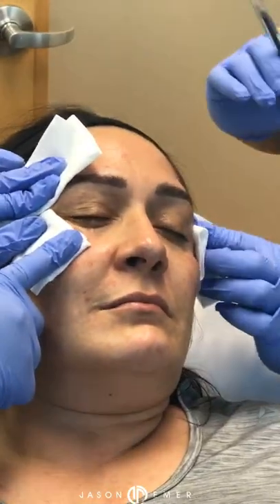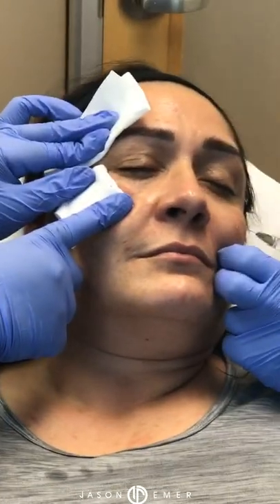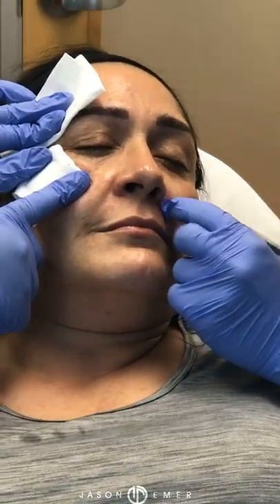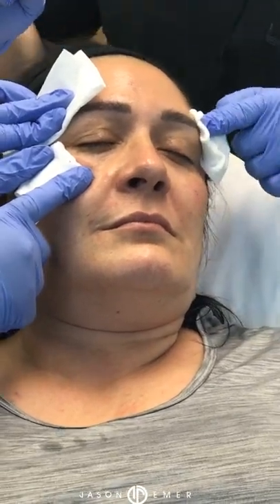For her, though, we have to do a bunch of contouring. I'm just doing a little blending right now to give her cheeks a lot of balance. Perfect. Okay. I'll just switch with me from behind. Hold those fronts. So now we have lateral cheek, elevation of the brow.